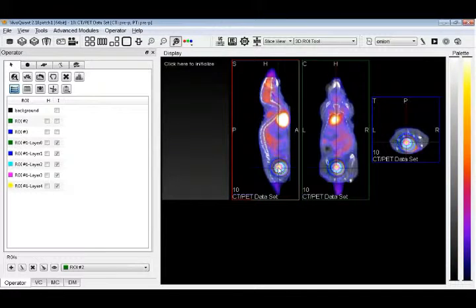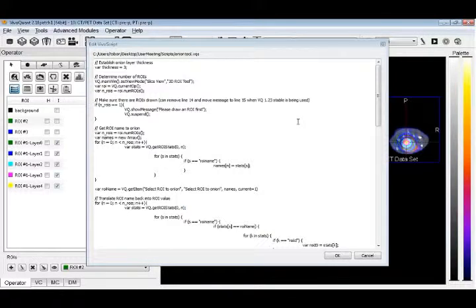And if it hasn't, then the user can directly go into the registration tool or move it around itself, and when it's done, click on continue, and then it proceeds. There are also ways to just show a modal message, or in the Onion example that Fiona showed, it also asks you questions like which ROI do you want to work on? That question, select ROI to Onion, is asking you to pick from a drop down, and all of that is already implemented in VivoScript.